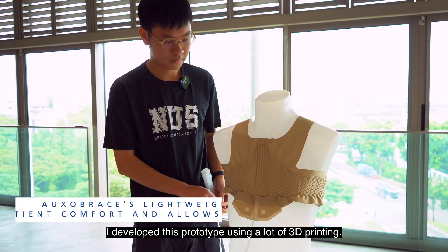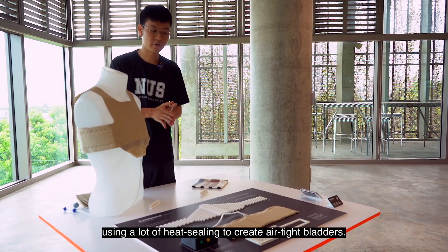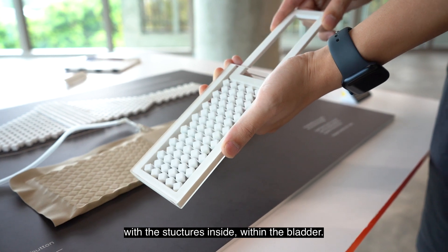I developed this prototype using a lot of 3D printing. I 3D printed a lot of structures like this, and using heat sealing to create airtight bladders. These bladders are able to contract with the structures inside the bladder.